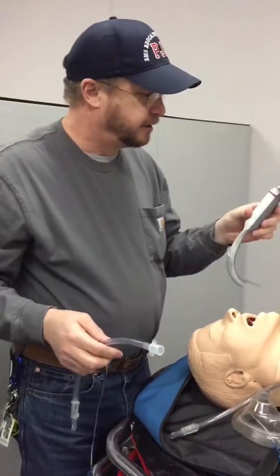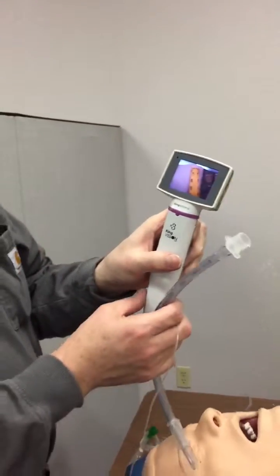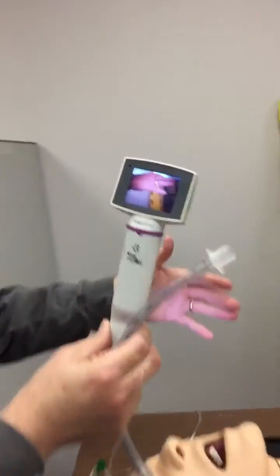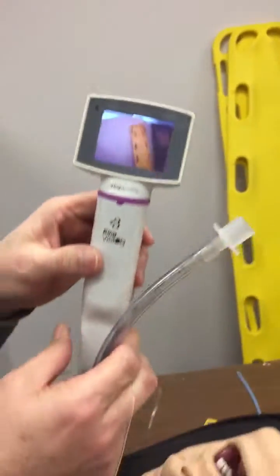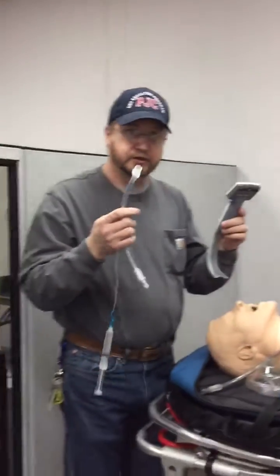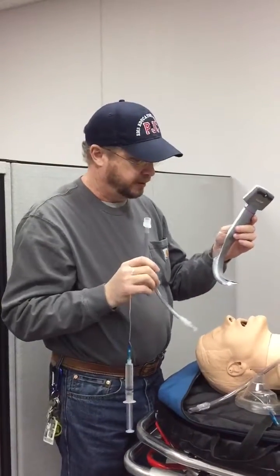This is a King Vision laryngoscope that has a video camera on it. You can see my hand out there as you're looking at the screen. This gives us the ability to go down and actually visually see a full view of the vocal cords and actually watch that tube pass through the glottic opening.